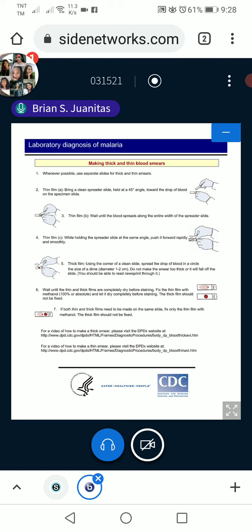Okay, so papunta rin yung quality control, no? So hindi na natin kailangang discuss yun. Okay, so now let's watch yung video about thin preparation naman. Okay, that's the preparation for the thick. And again, ito naman yung thin preparation.